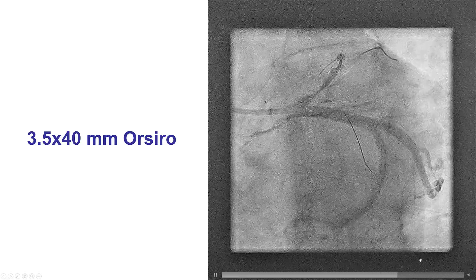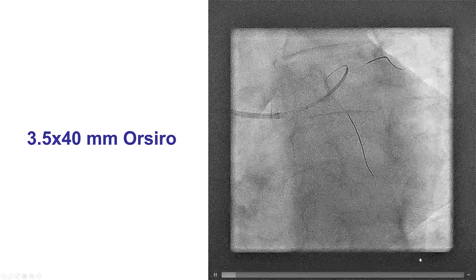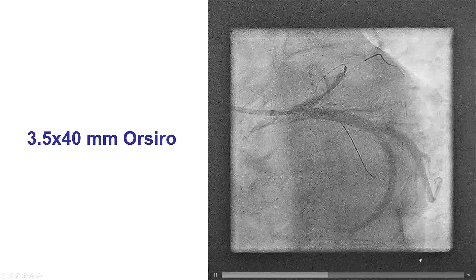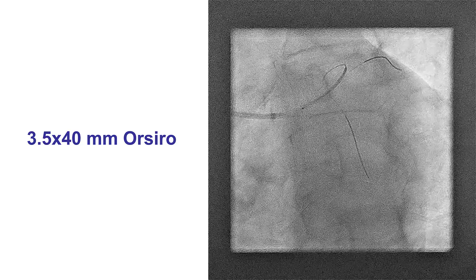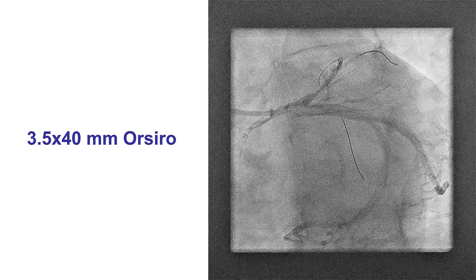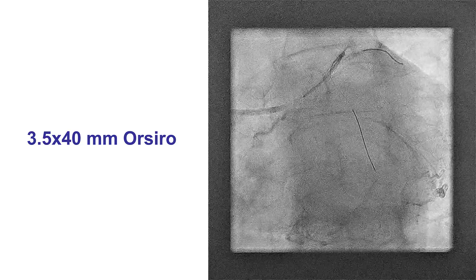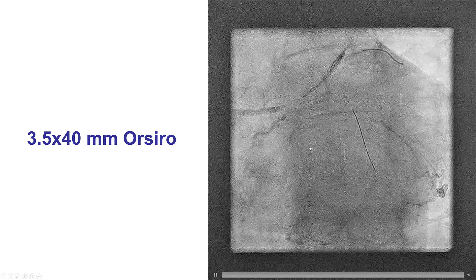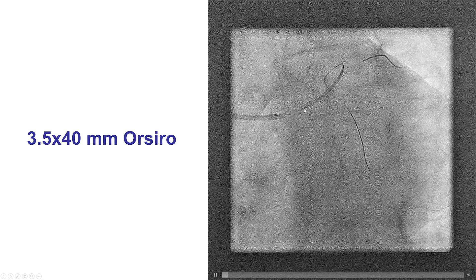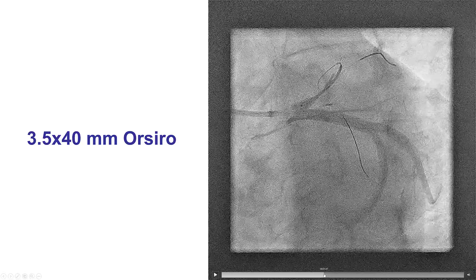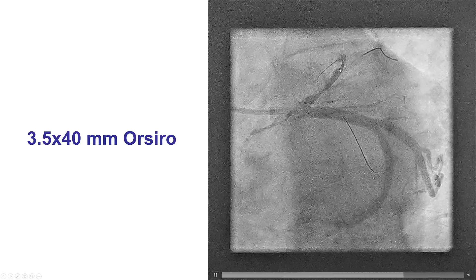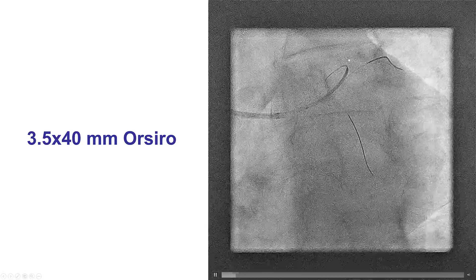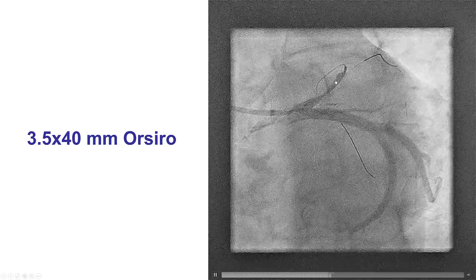We decided therefore to treat this with a primary stenting approach. We used a 3.5 by 40 millimeter Xience stent, with the intent to place it from the ostium of the LAD all the way to the mid-LAD, past the origin of the diagonal branch.